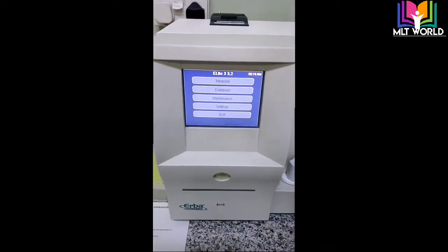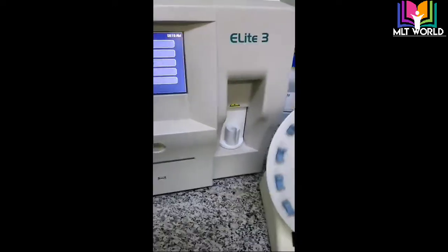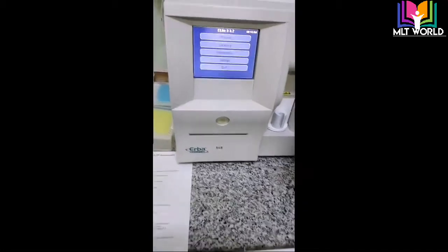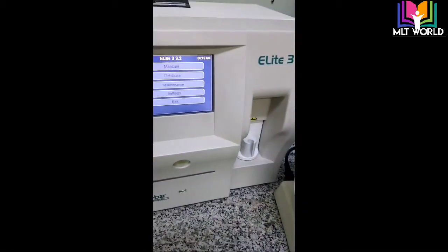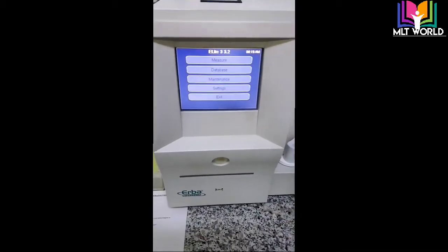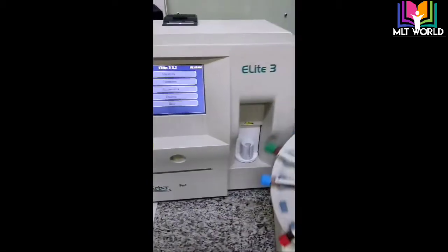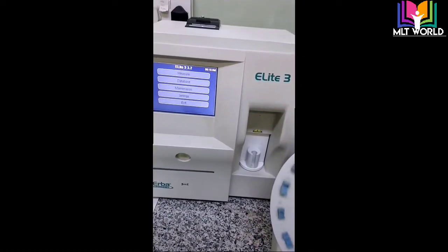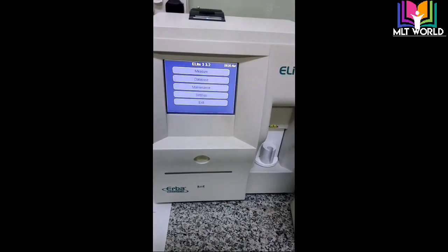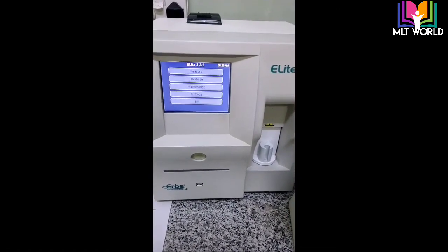I recommend this machine — it is very good for medium and small-level clinics because a three-part machine is sufficient for small-level testing. However, for high-level hospitals it is not recommended, because for more detailed studies we need a five-part machine. The only drawback of this machine is that it is not a five-part analyzer. In all other aspects — results, ease of use, every point of view — this machine is excellent.